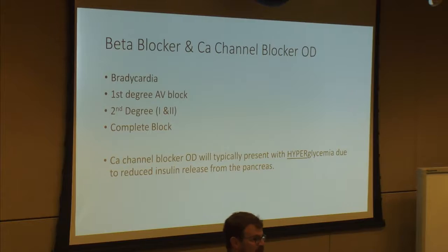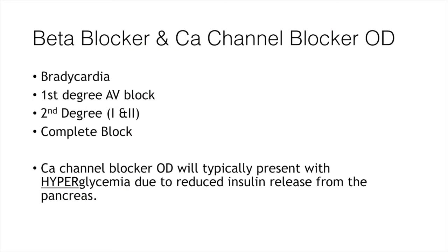So that's QT prolongation. So we've talked about sodium channel blockade and QRS widening. We've talked about QT prolongation and how to identify those. How about beta blockers and calcium channel blocker overdose? What's it going to manifest like, right? Well, think about these drugs and where do they work? They work at decreasing or delaying the transition of the signal, one, the propagation of the signal, and two, the transmission of the signal through the AV node.